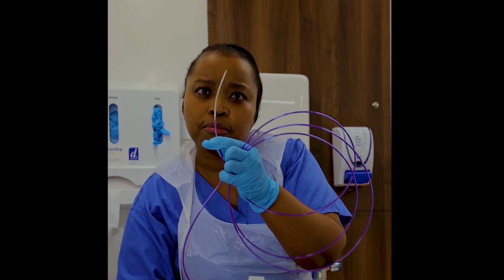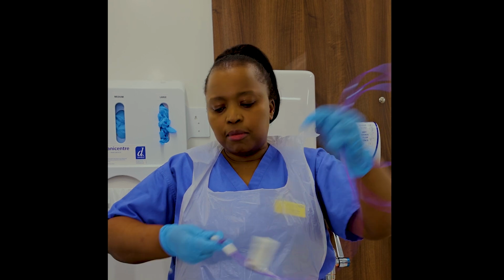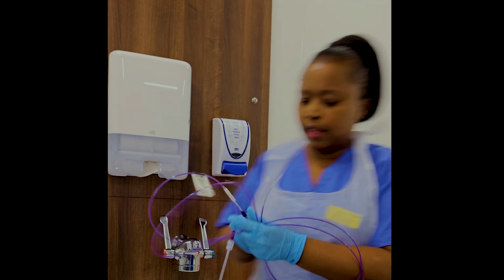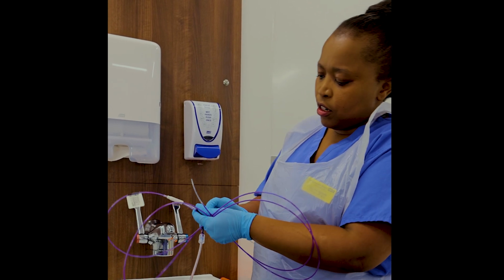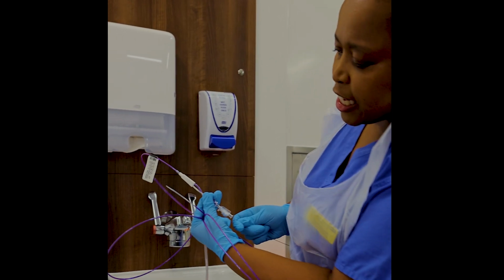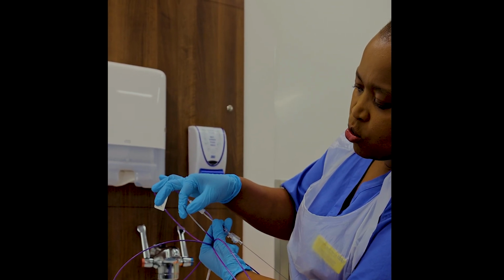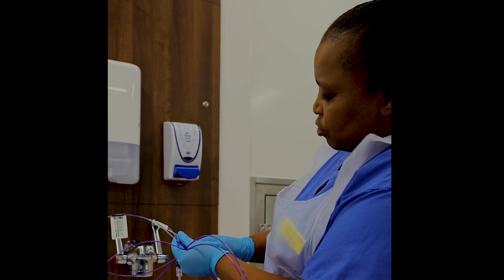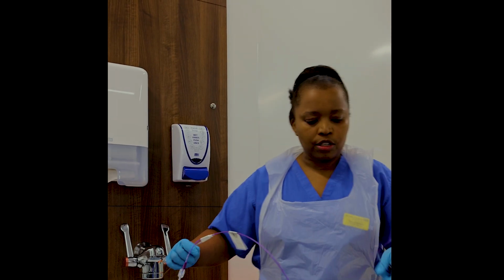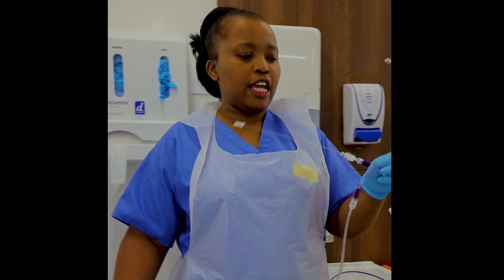just have a look. When you look at the tip there, the guide wire is a bit at the back. So what I'm going to do is to advance it a little bit. And then I'll unlock. This is the locking and unlocking, as you can see. Now I'm able to advance it up to the end where it's just okay, so that the balloon is not going to be wobbly. Yeah, so now lock it. Why do we have to lock? So that during the insertion, you don't have to worry about that. You just give it to the endoscopist, and then it's not going to be on, just confusing everybody. And then that's fine. The endoscopist will now start.